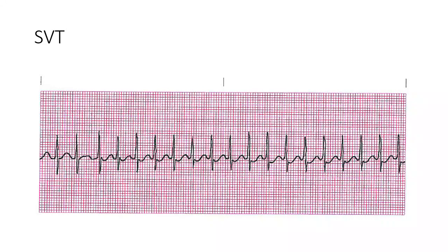VTAC is like bizarre looking, where it's coming from the ventricle. What's bizarre looking? The QRS complex. Perfect. So that's the kind of thing that you're going to look at. Keep in mind, as you continue your paramedic career, sometimes you will have rhythms that kind of look like SVT, but then again, kind of look like VTAC. I'll give you some strategies and some medicine, adenosine, that will help you narrow that down and identify which is which.